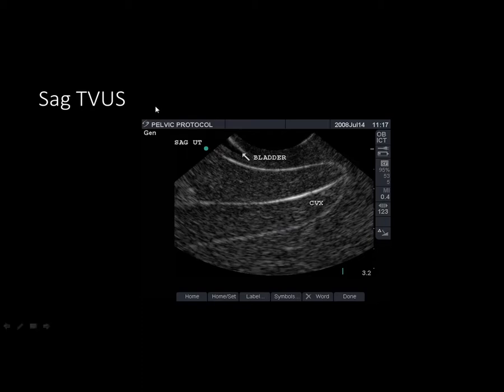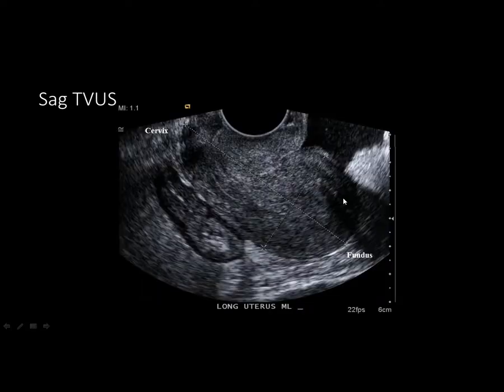When we enter for the transvaginal ultrasound, the first thing the provider will encounter is the cervix. The bladder will be balloon-shaped and pointing towards the cervix. The posterior cul-de-sac will be visualized just posterior to it. Occasionally, the provider may see this image. This is a retroflexed uterus. Unlike the previous image, the cervix is now on the leading edge and much more anterior as the retroflexed uterus falls posterior.